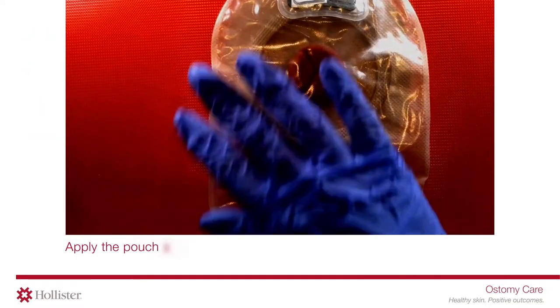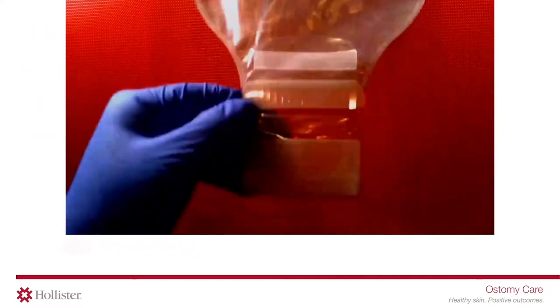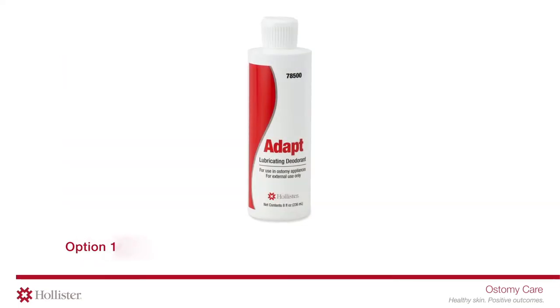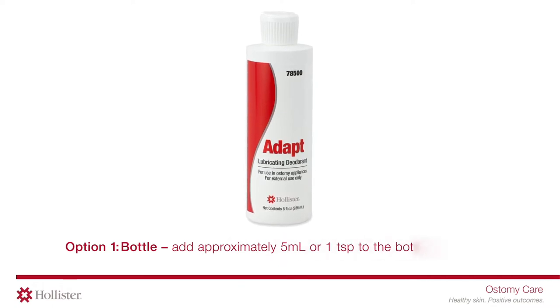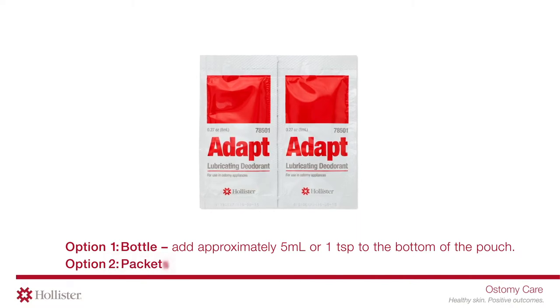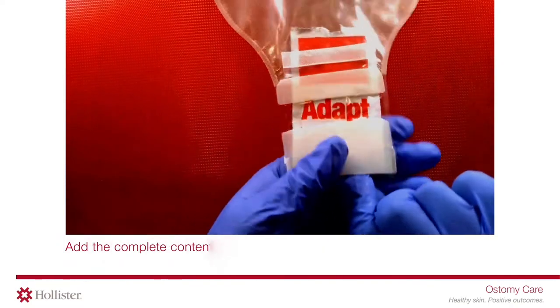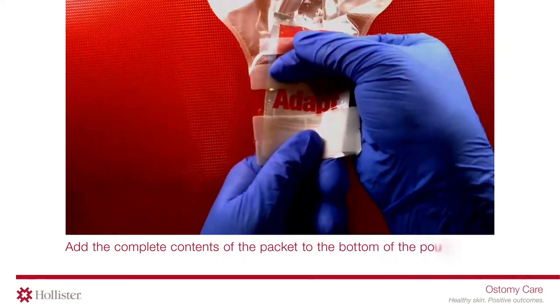Apply the pouch as usual, then add the lubricating deodorant. Option one — bottle: add approximately five milliliters or one teaspoon to the bottom of the pouch. Option two — packets: add the complete contents of the packet to the bottom of the pouch.